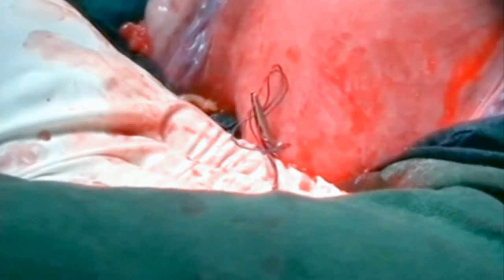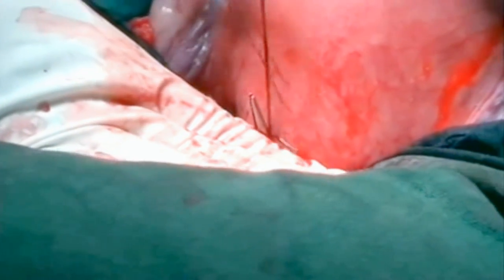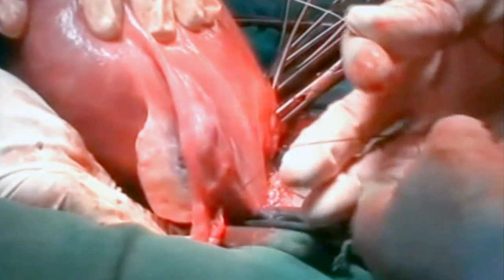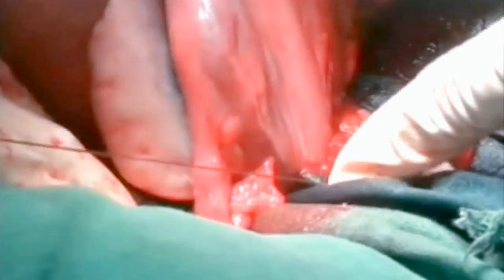Now this is the posterior side — you can see the tip of the forceps. Open the forceps and pull out the threads. Take out the forceps and take one thread to the left side and tie as tight as possible and as low as possible.